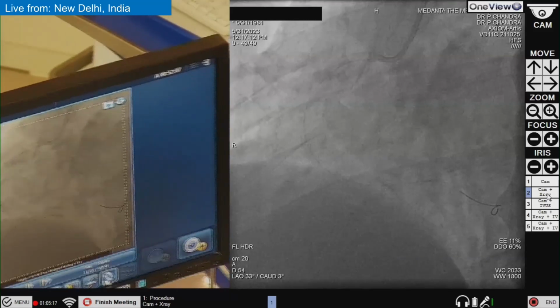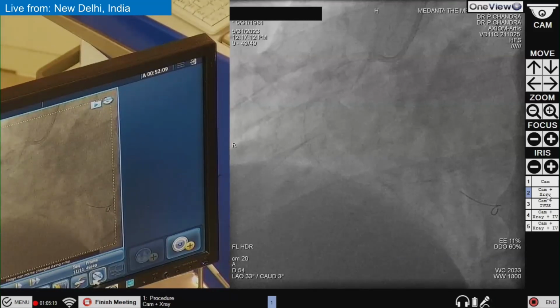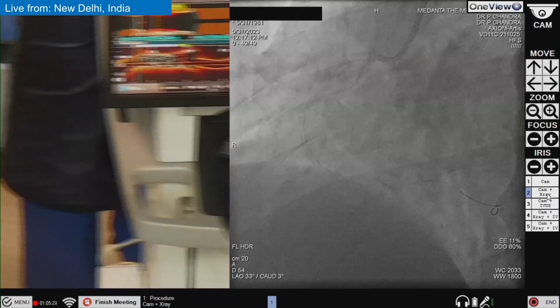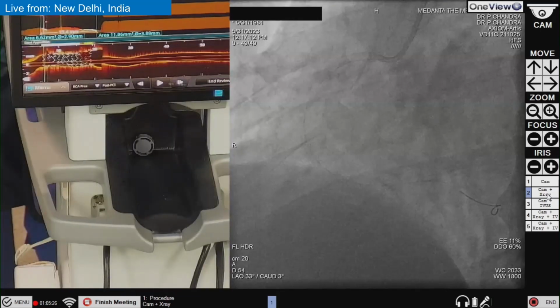And in one, we can do one more OCT. Proximal? One more OCT we can do, no problem. Just to demonstrate that yes, everything is okay.